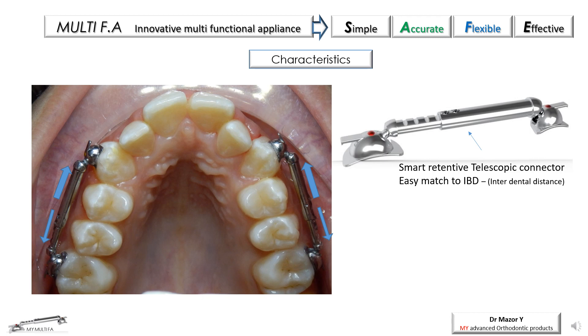A smart retentive telescopic connector is a major element of the appliance, allowing immediate and accurate match to the changing interdental distance. This obviates the need for preliminary distance measurements or keeping a stock of appliances in variable sizes.